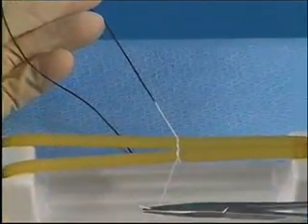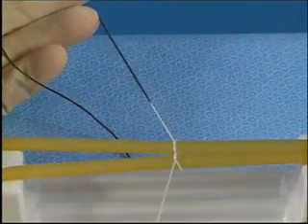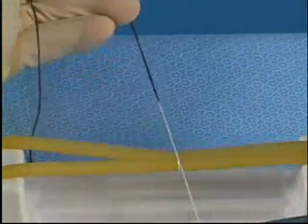As you can see, the suture material is wrapped twice in the first loop, increasing the friction and allowing the surgeon to maintain tension on the knot after it's tightened.